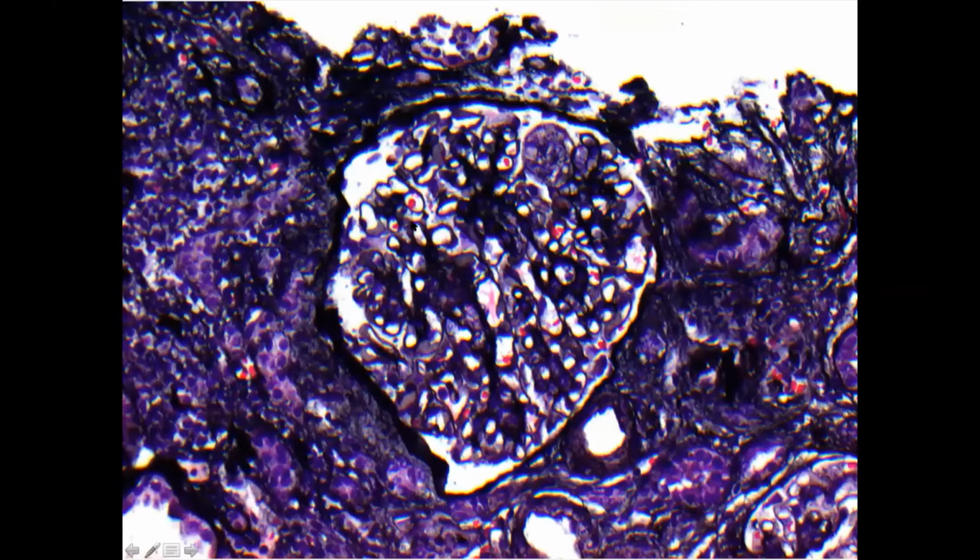Okay, هذا السيلفر stain يراوينا شيء. I don't know, for those of you who took notice, there is a focus of endocapillary hypercellularity. اوكي هذا يعني احنا طالعنا كل الجلوميرولاي الموجودين على كل الليفلز, بعدين focally in one glomerulus على السيلفر ستين بين إلينا إن there is endocapillary hypercellularity.